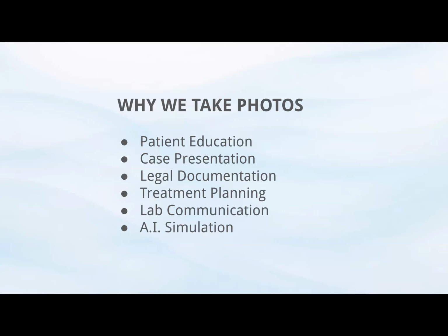Now, why do we take the photos? First of all, is for patient education. Most people don't really know what their teeth look like from different angles, and you're going to find that a lot of them are surprised when they see what's happening with their teeth in the back or behind the teeth. Obviously, we use those for case presentation because it's a good way to define expectations for the patient. What is it that we can do and what is it that we can't do?